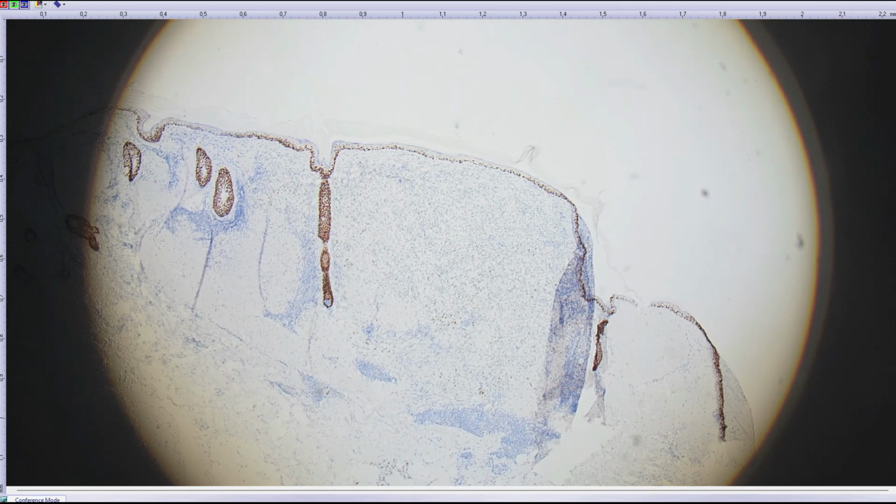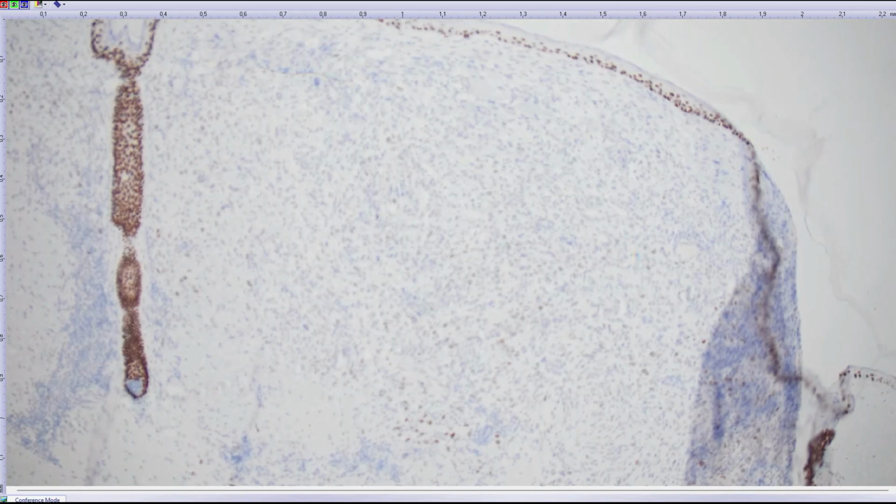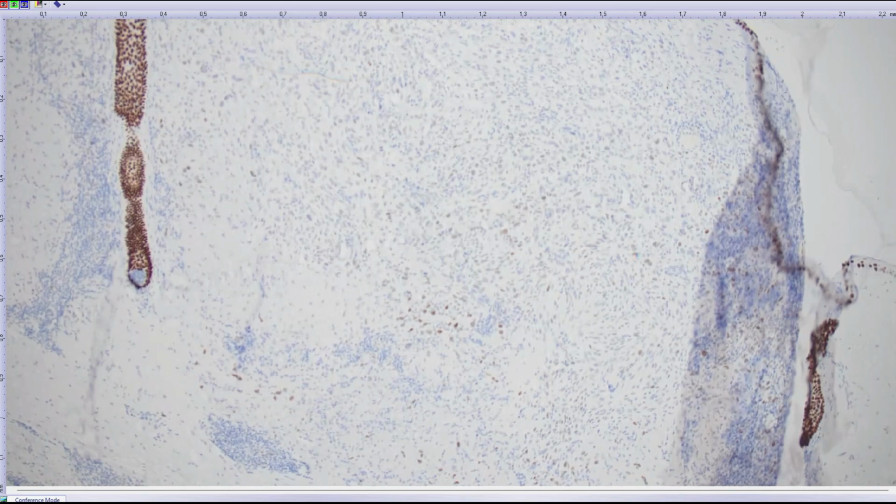So you do a broad immunohistochemical panel: cytokeratins, SOX10, S100, P63, h-caldesmon, desmin. This is a good panel to start with. Everything was negative except for P63, which showed focal weak positivity, which is quite unhelpful.